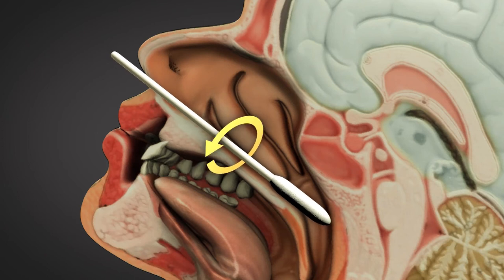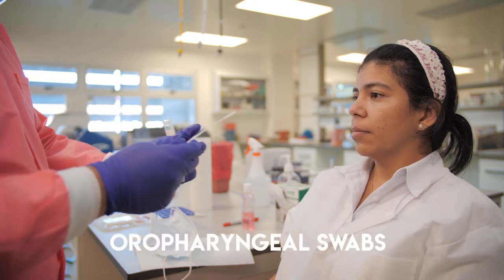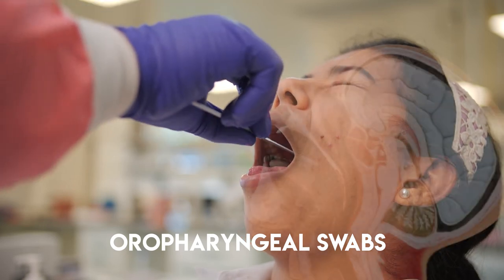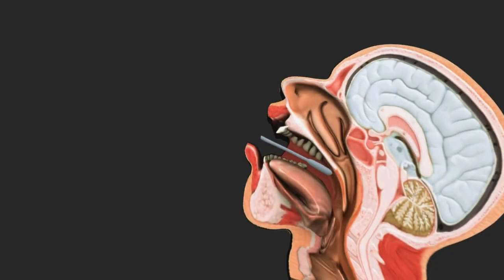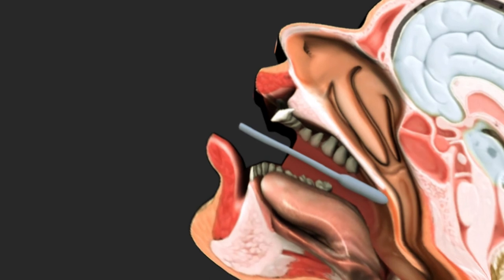Place the swab immediately into a tube containing the viral transport medium. Remove the oropharyngeal swab from its packaging and insert it into the posterior pharyngeal and tonsillar areas. Rub the swab over both tonsillar areas and the posterior oropharynx, avoiding touching the tongue, teeth, and gums.